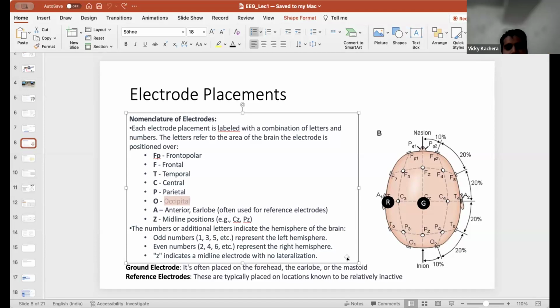With the loose electrode system, we can decide where we want to place it. I need to check the ground electrode. In the caps that we have with fixed electrodes, check where the ground is and where the reference is. How do I know which one is ground? Ask Nitesh, ask Rahul, or check the brochure of the cap. Figure it out.